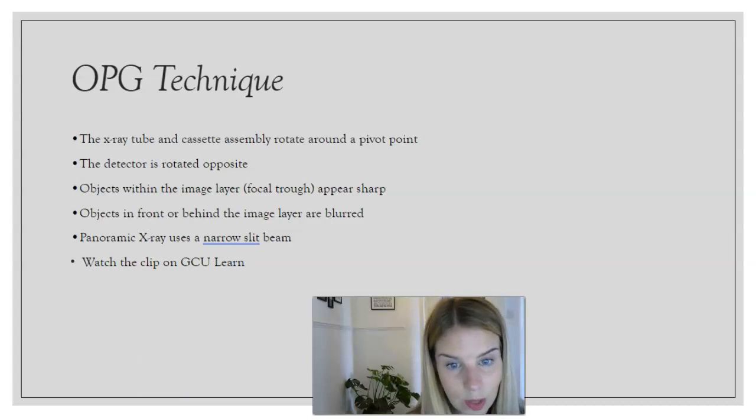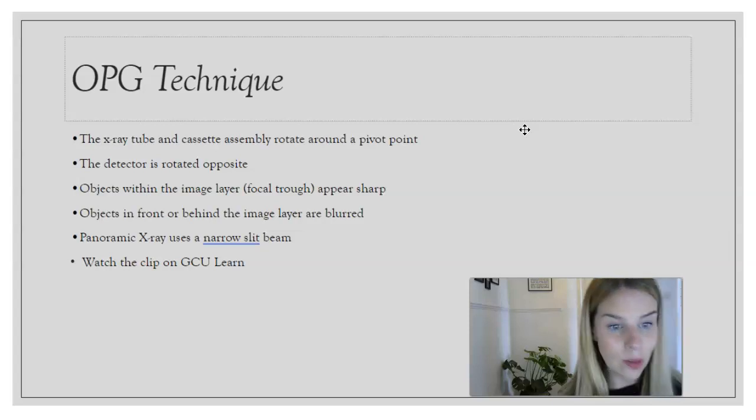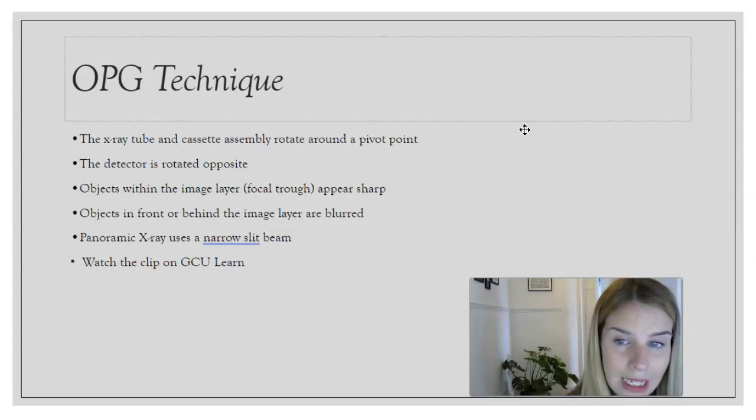In terms of techniques, this is when it can be a bit tricky. We used to do these on pediatric patients, and it was always a total nightmare, like getting a 7-year-old to stand still while something rotates around their head. So yeah, they can be a wee bit tricky. And I think also for an adult, if you have someone who's maybe intoxicated or someone who's maybe not cooperating, they can sometimes be a bit of a nightmare. Quite often they can come in when you're on night shift because somebody's been punched in the face or whatever it might be. So sometimes they can be a bit tricky, but once you get to know your machine and you practice quite a lot, you'll become more confident with them.